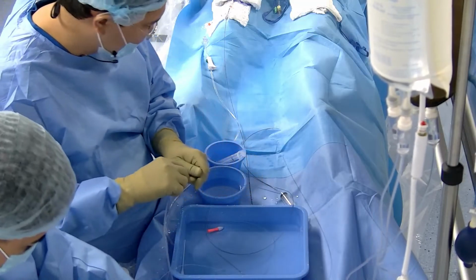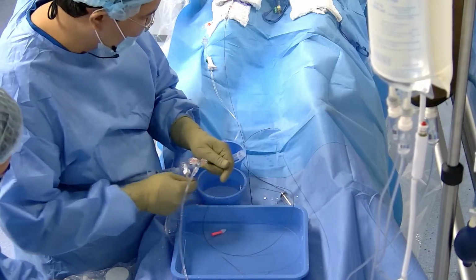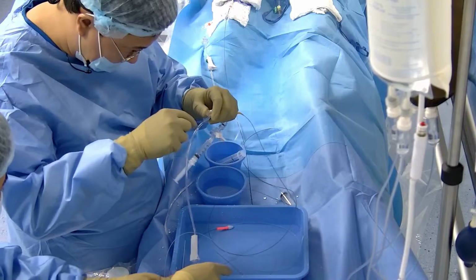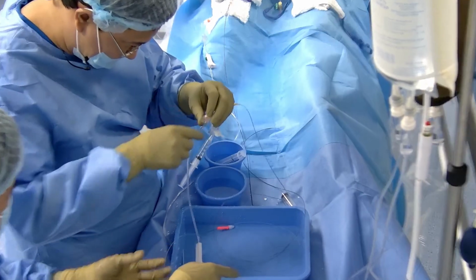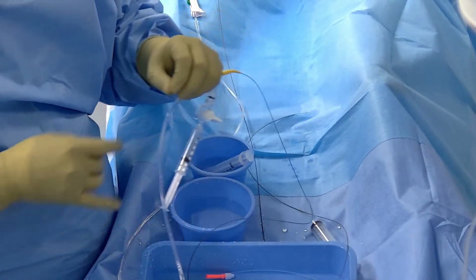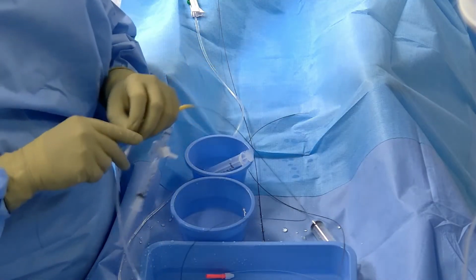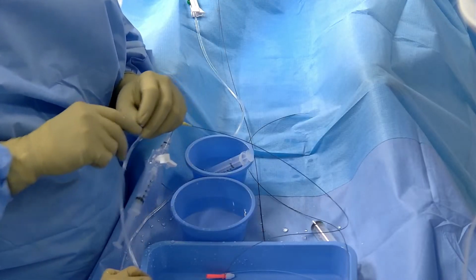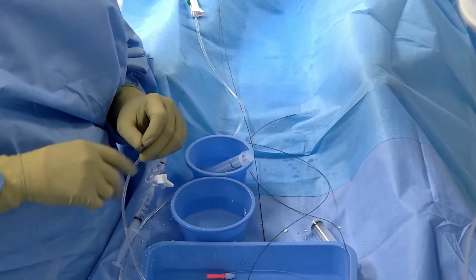If the balloon is okay, then I prefer to go directly in place, but what I learned from René Chapeau and the other colleagues, Alberto Gil from Spain, Charbel Monayer from Limoges, France: if you want to confirm the proper preparation of the balloon, it's better to inflate it in the cervical ICA, in a safer place.